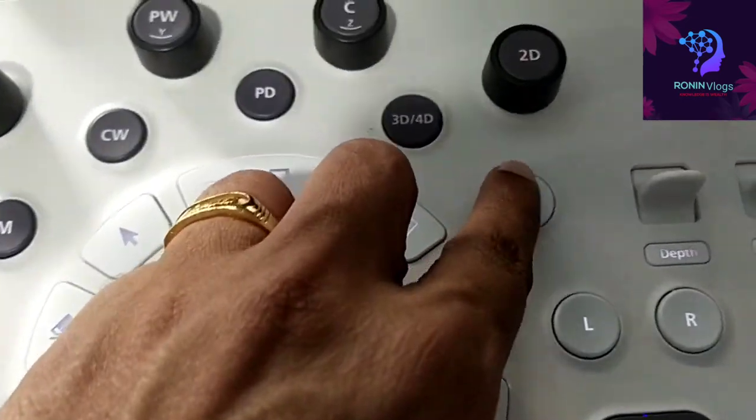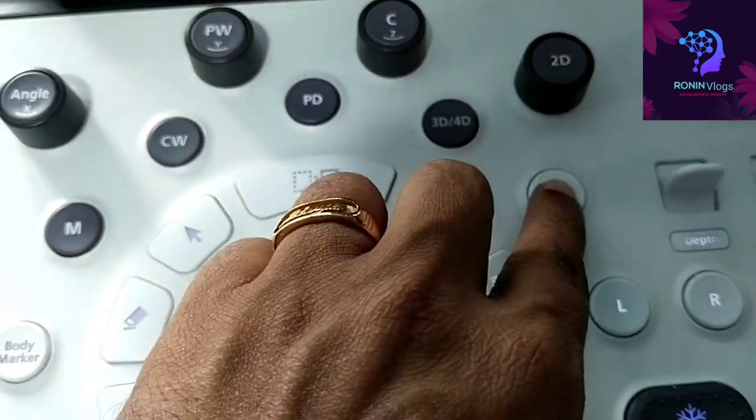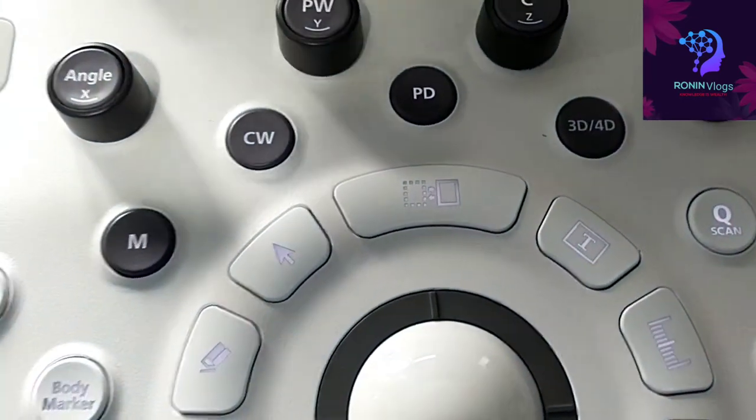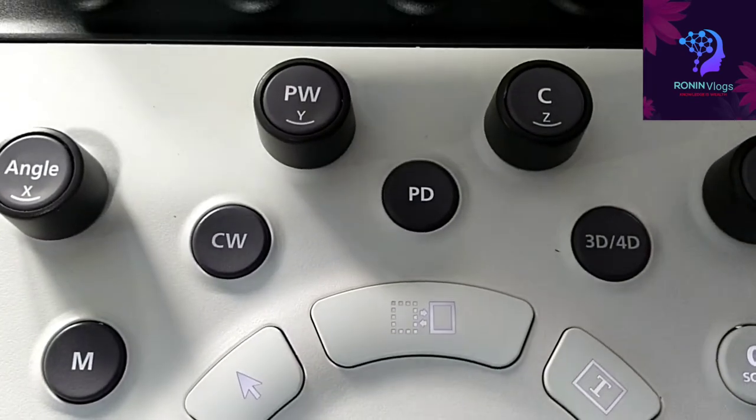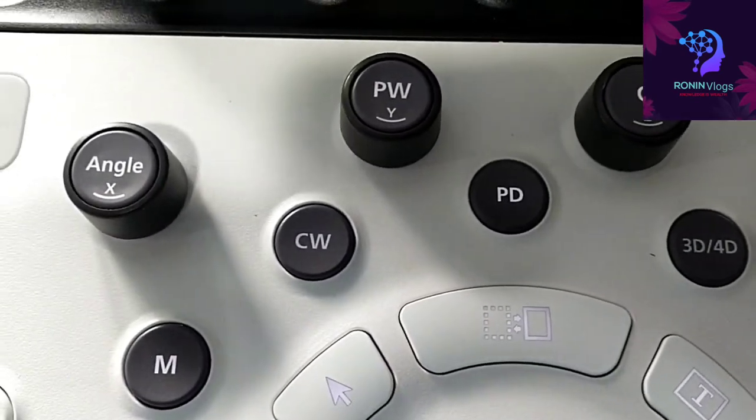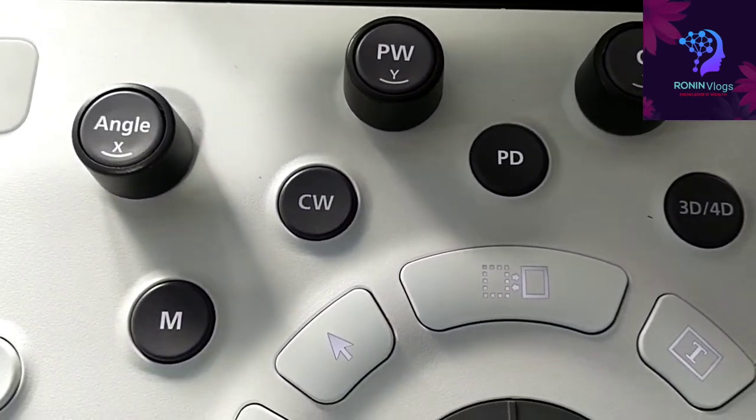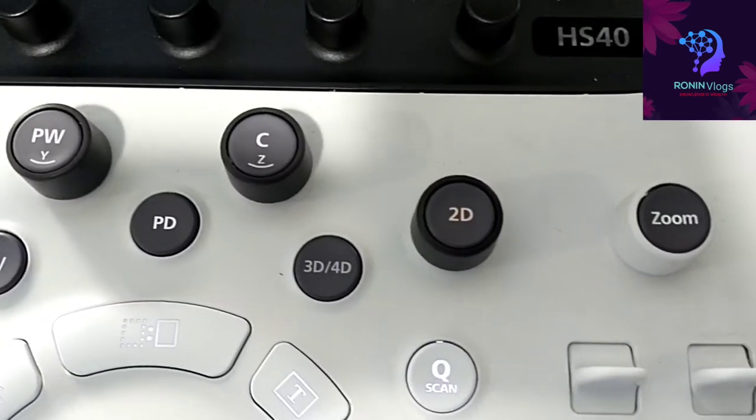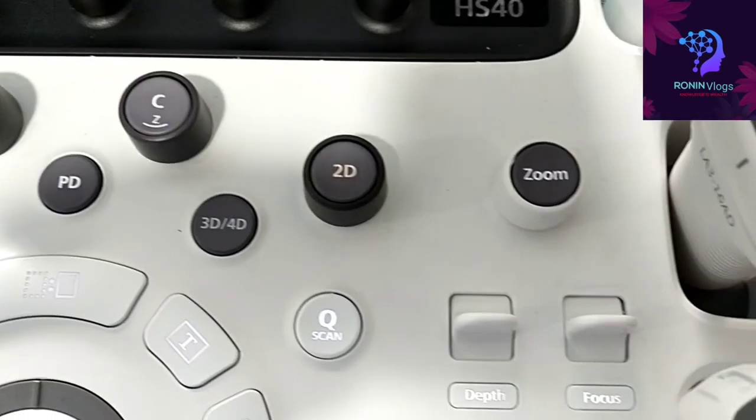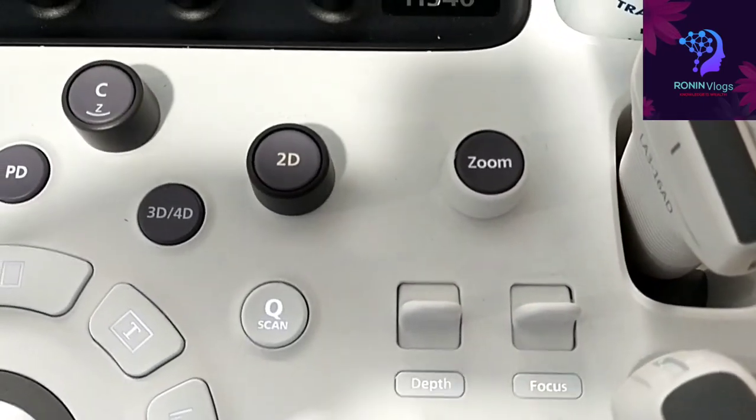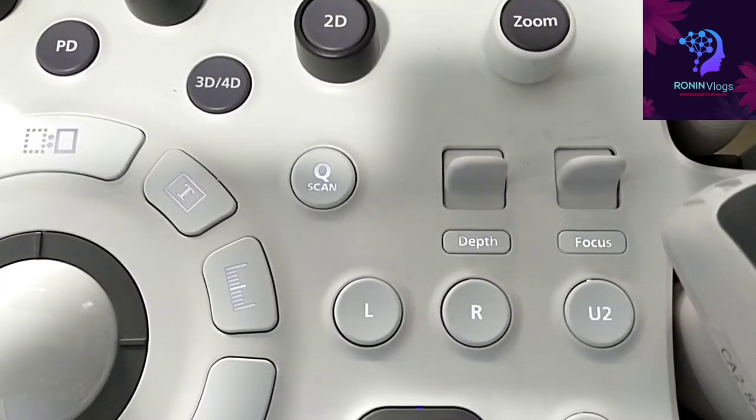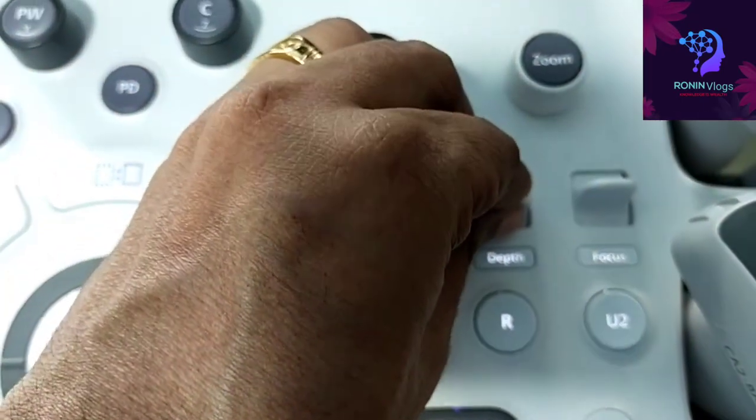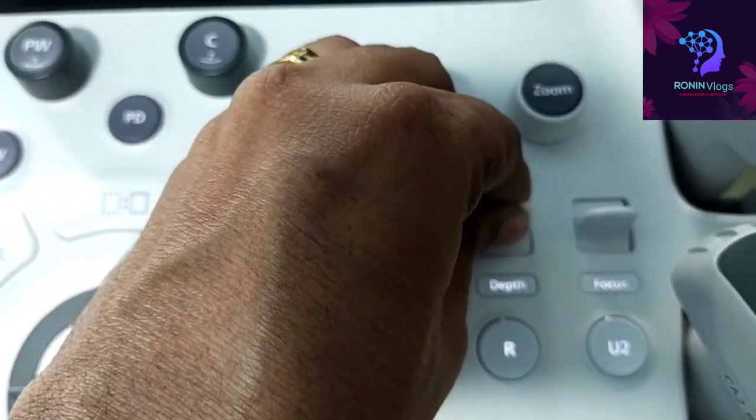These are the main controls. Angle, everything available. Tap the focus, everything available. We need to adjust like this.